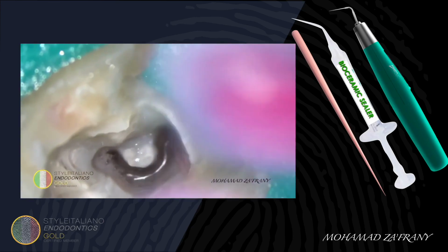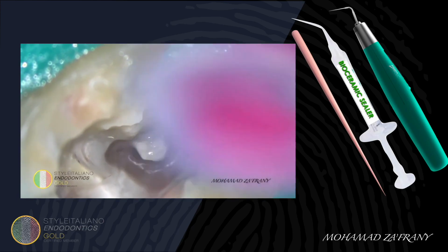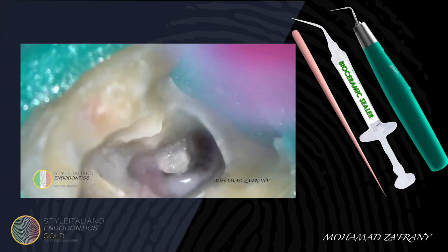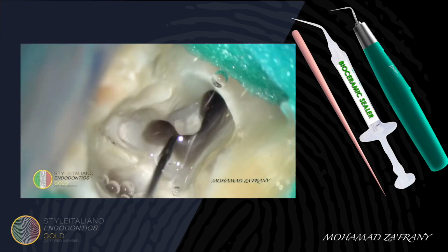And as long as we're going deep into the canal, I'm relying more on sonic activation just for safety. Final flush.